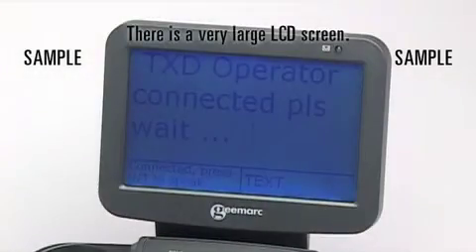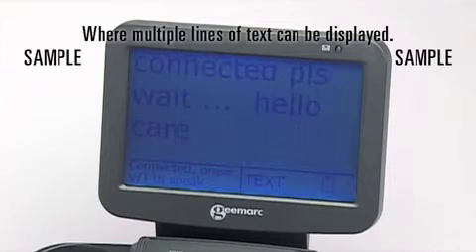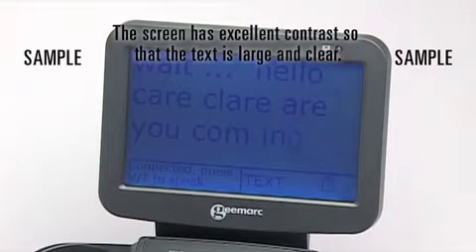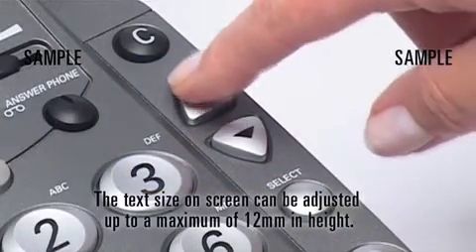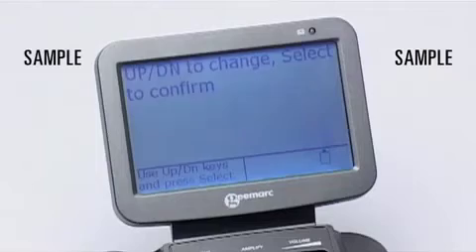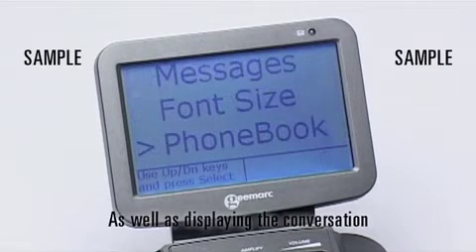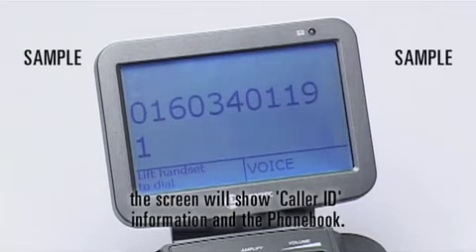There is a very large LCD screen where multiple lines of text can be displayed. The screen has excellent contrast so that the text is large and clear. The text size on screen can be adjusted up to a maximum of 12mm in height. As well as displaying the conversation, the screen will show caller ID information and the phone book.